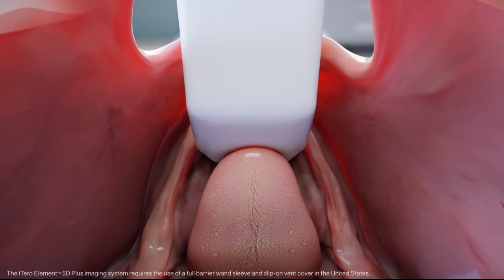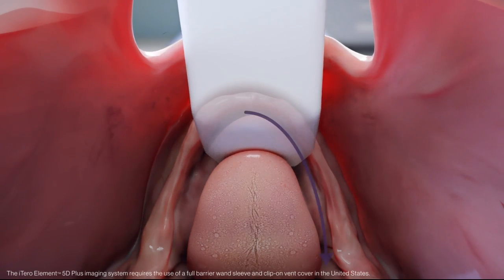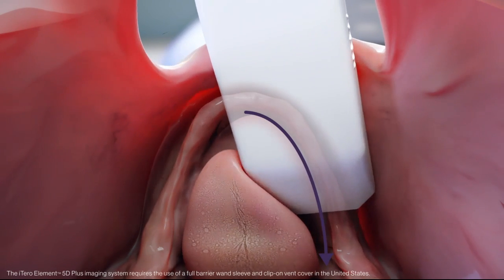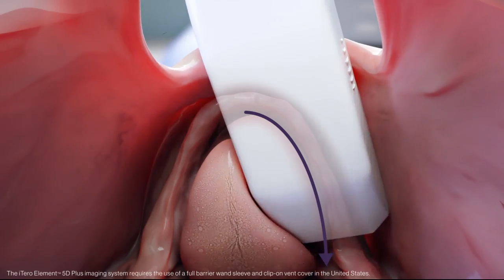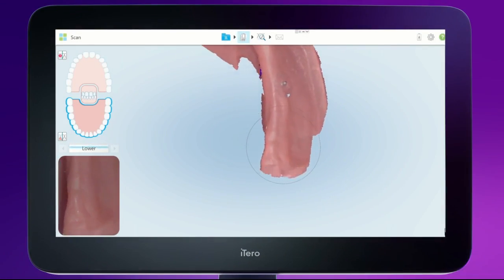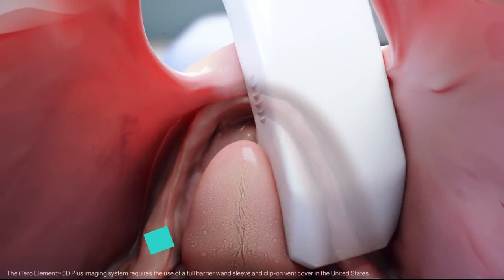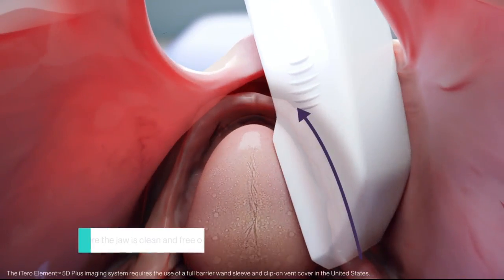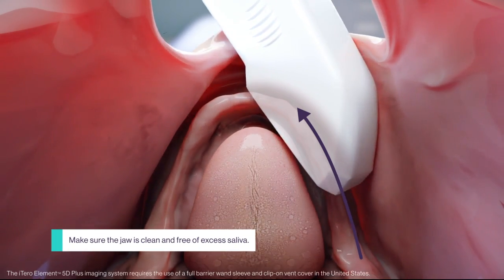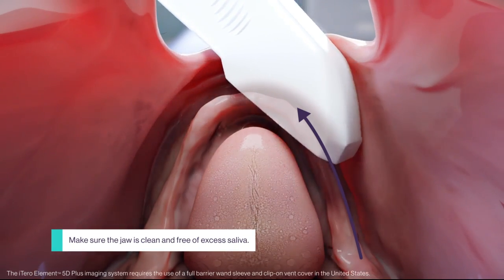To scan the buccal quadrant, position the wand on the ridge at the midline and turn on the wand. Complete the scan of the lingual surface while retracting the tongue. Scan the retromolar pad, roll over the ridge into the buccal, and capture the distal buccal of the ridge scanning to the midline.